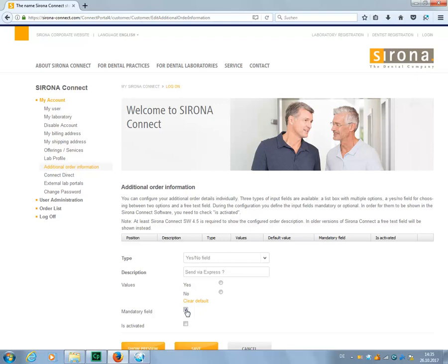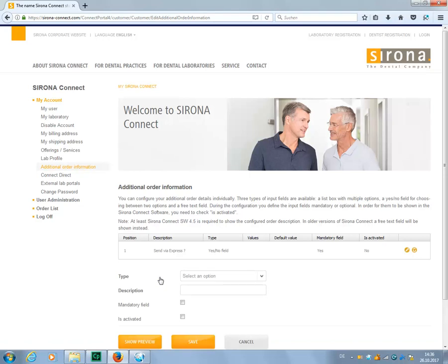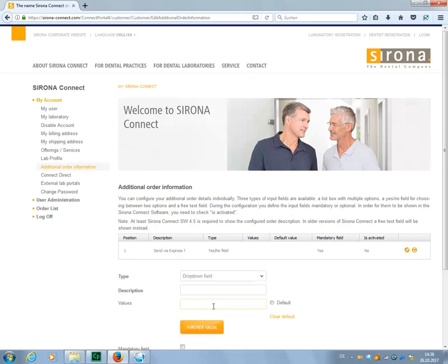Each new input field that you create must be saved before you can proceed with a new order description. Let's click again on New Order Description and take a look at the next option: drop-down field. As before, we first need to specify a heading, for example, Material. Under Values, you enter the different selection options that will be available for the dentist in the drop-down menu in the Sirona Connect software. Let's define a total of three selection options: Material 1, 2, and 3. We can generate additional fields by clicking on Further Value.